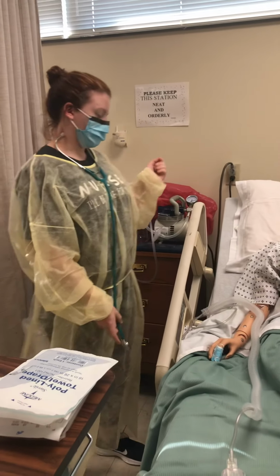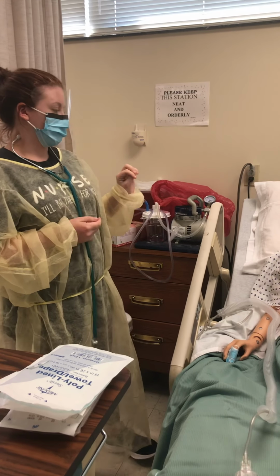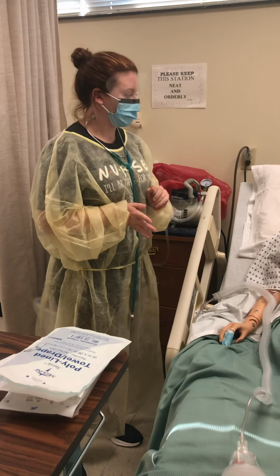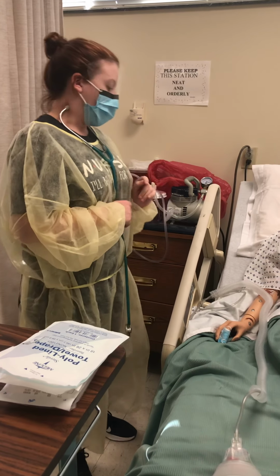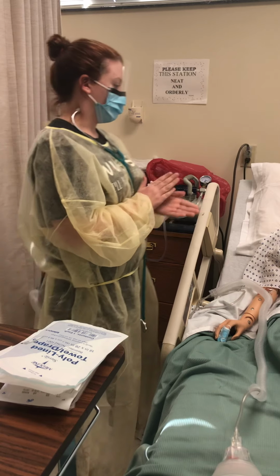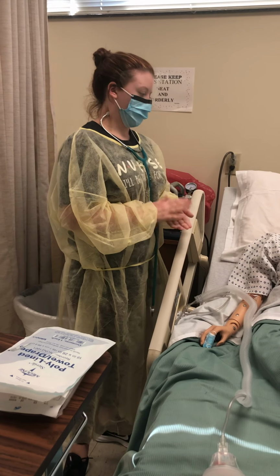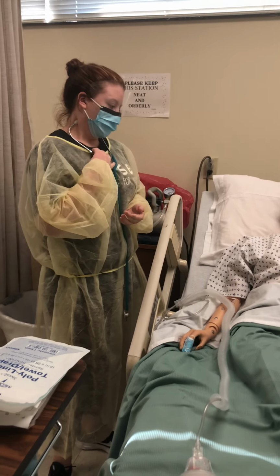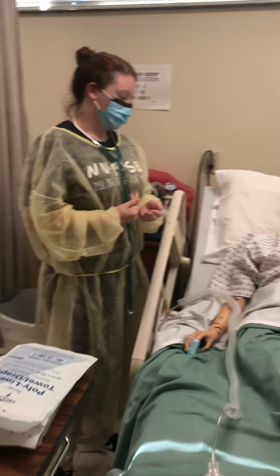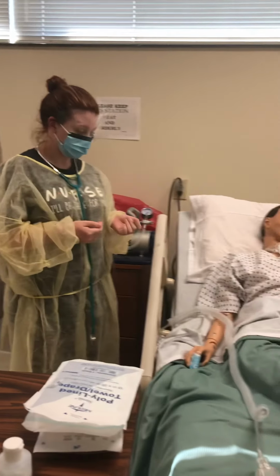I hear bilateral crackles in his lungs, and his O2 sat is 89%, and I see some sputum in his trach, so I do need to suction him. I'm going to explain to him that I'm going to stick a suction catheter into his tracheotomy tube to hopefully get some of that mucus out of his chest so that he'll hopefully be able to breathe better.